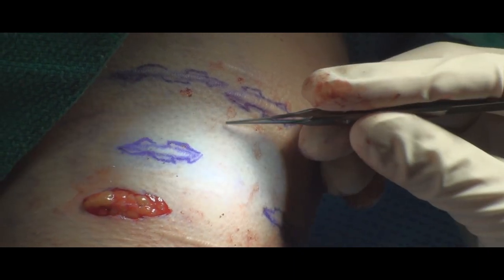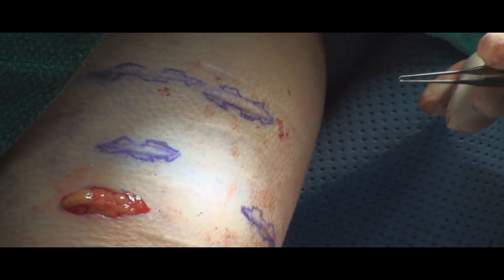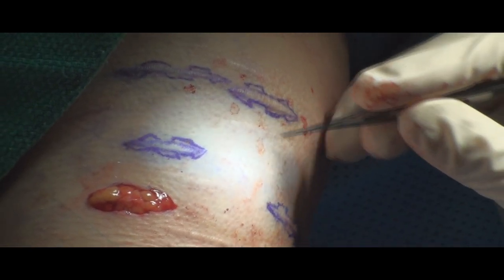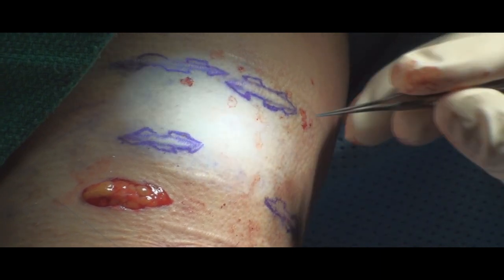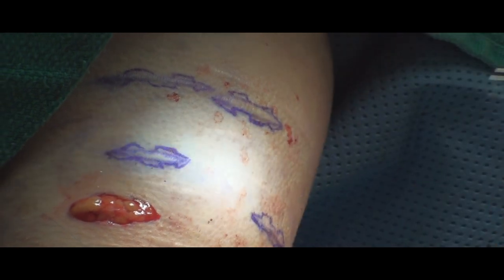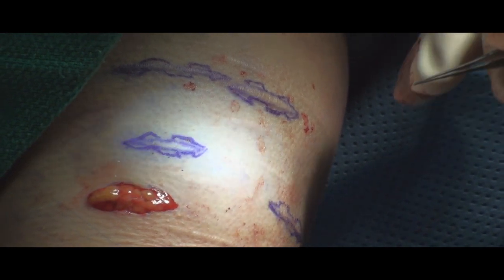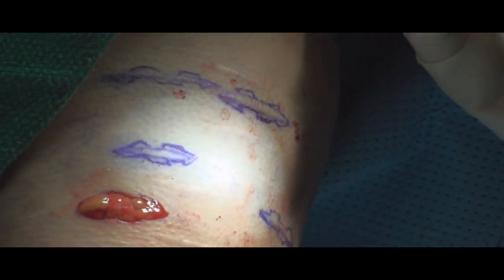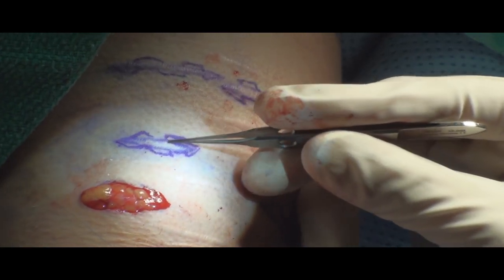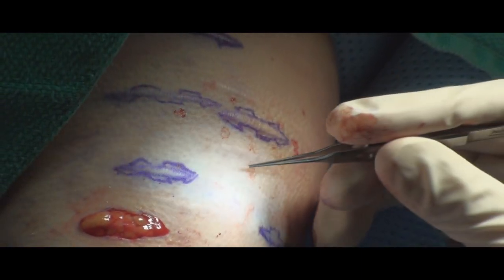And that's the whole principle behind the geometric line closure. The other way to do this is to do a running W-plasty closure. That does satisfy the goal of breaking up the long incision or a long scar that is longer than 0.7 centimeters. However, with the running W, it creates a pattern that people will notice. So the geometric line closure is an improvement on that idea, in the sense that you're doing either triangles, squares, or half circles, quarter circles to break up that straight line.